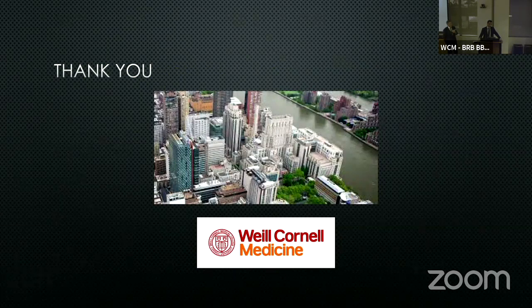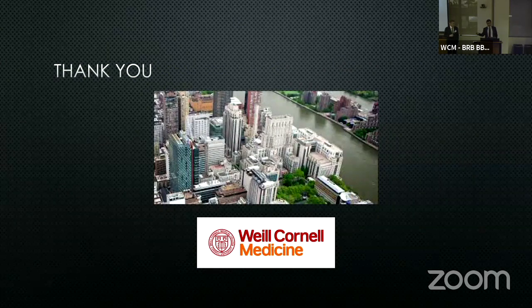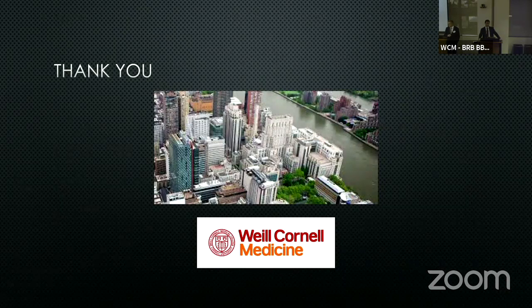If we're doing something like a T10 to pelvis, that often requires 2 stages. So we will get a scan with a reference in the middle, instrument, check, scan the rest of it, and then instrument below, and that helps a lot with that. I'm even more cautious in the cervical spine. So oftentimes I'll do C2 and C1 separately, and then do the junction and freehand all the mid subaxial cervical. So it depends on what you're doing, but there is certainly a concern there with respect to distance from the array, because that introduces inaccuracies.